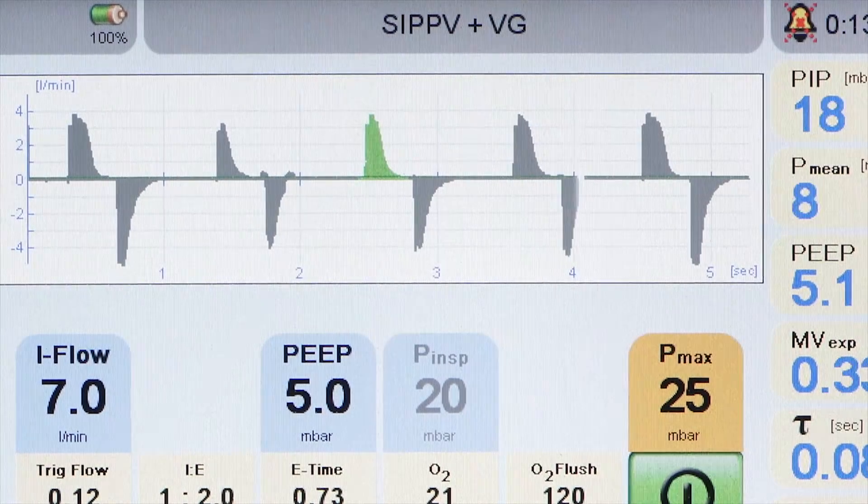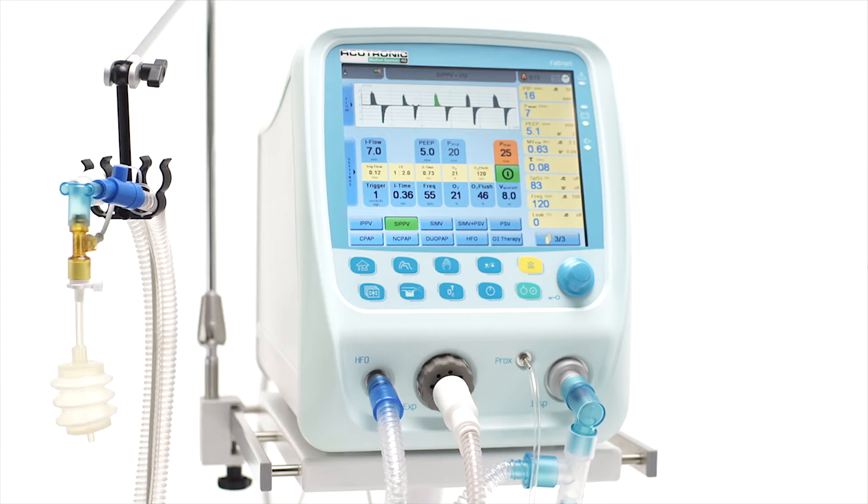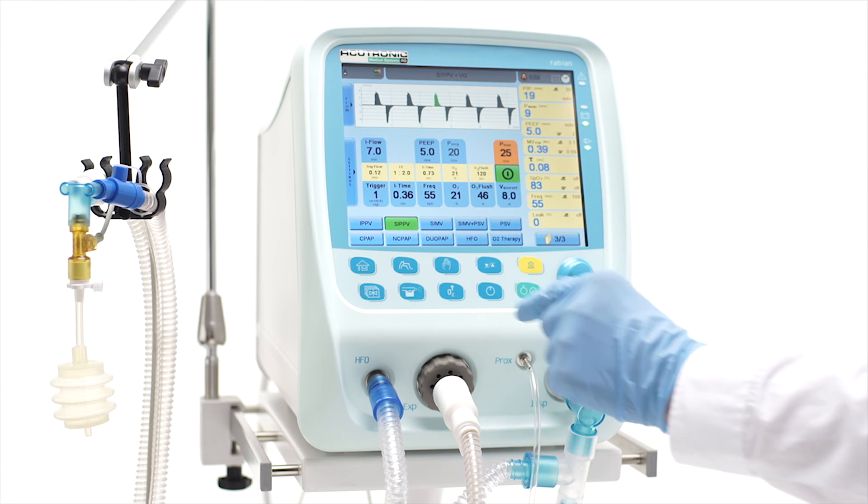SIPPV plus VG will appear in the status field display. Then properly set the other remaining parameters according to the patient's need, in the same way as shown in IPPV mode.